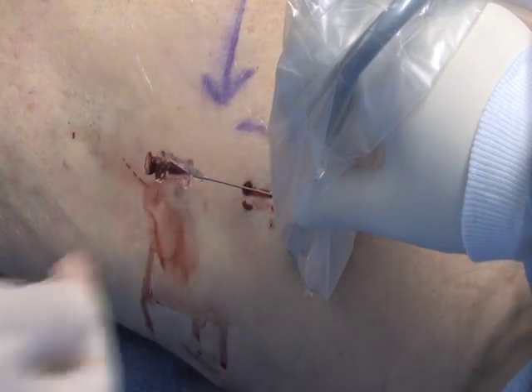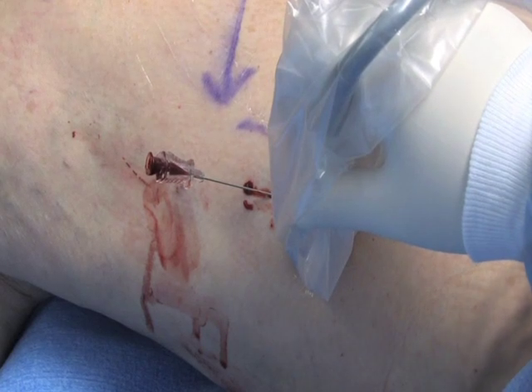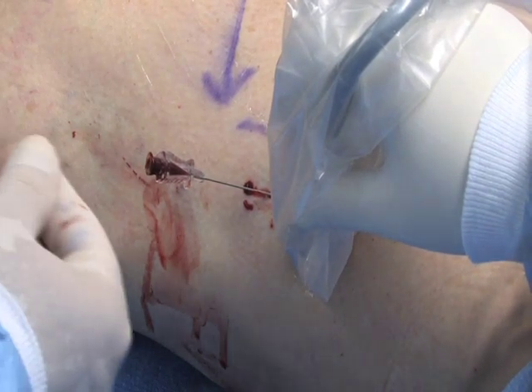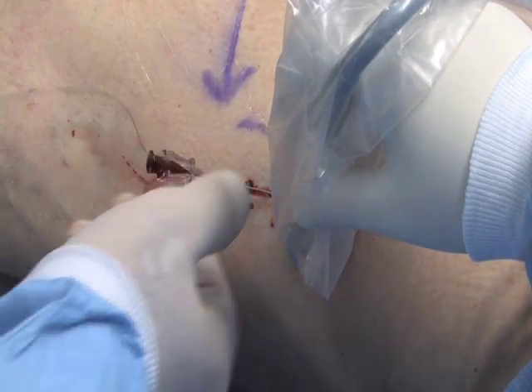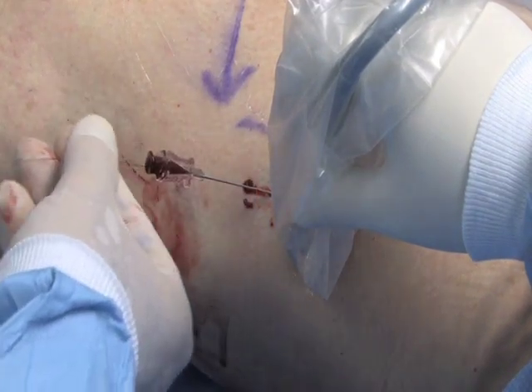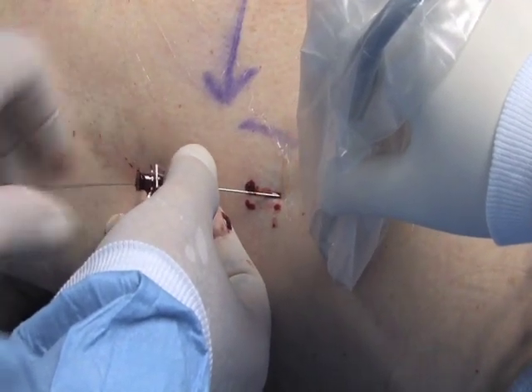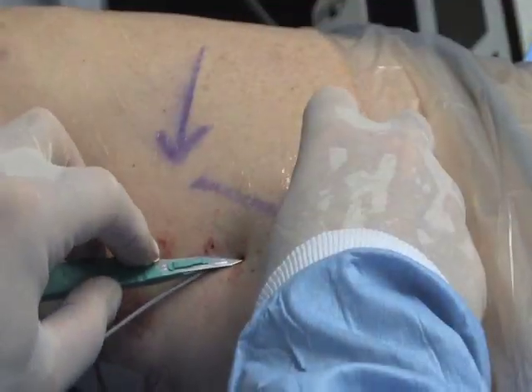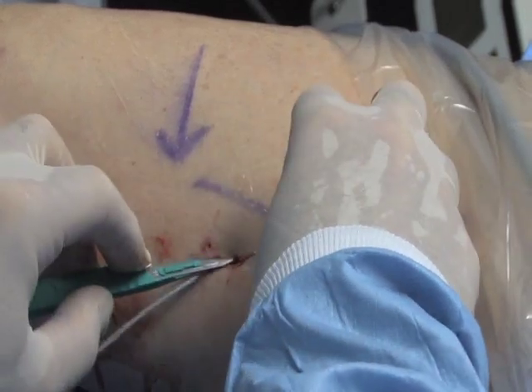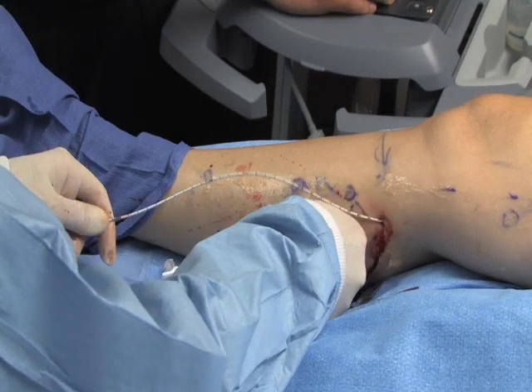Using the Seldinger technique, thread a J-wire into the vein. It may be necessary to advance the straight end of the J-wire if the greater saphenous is particularly tortuous. This can be done safely, but requires a delicate touch and should only be attempted by those who have gained experience with this technique. Use a number 11 blade to nick the skin along the wire and advance a 5 French introducer over the wire.